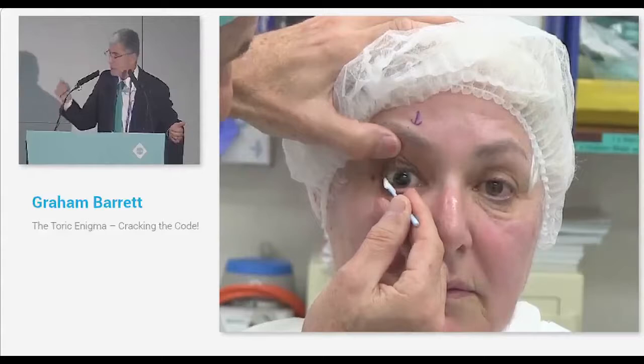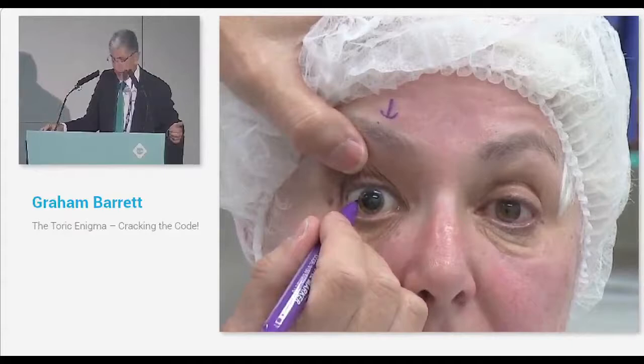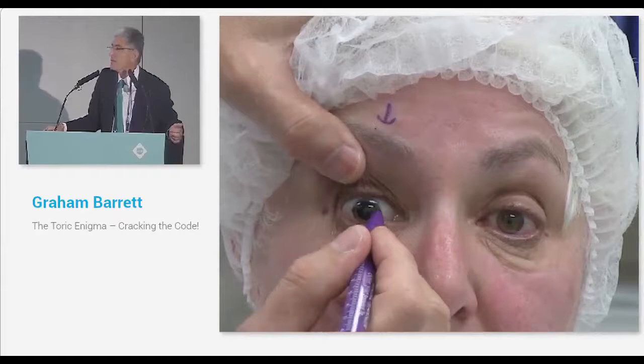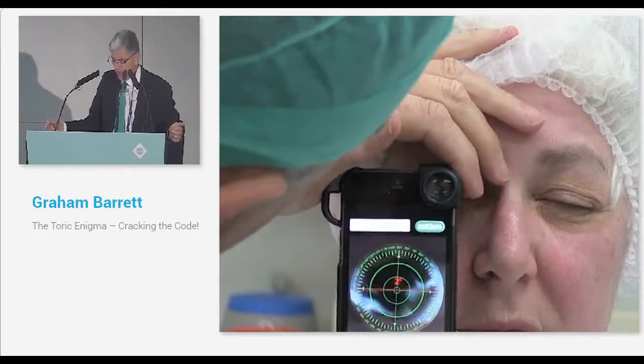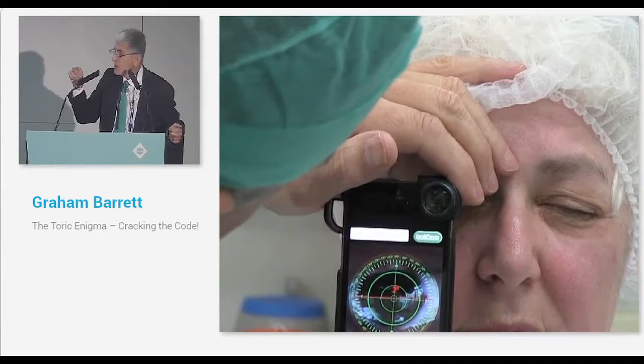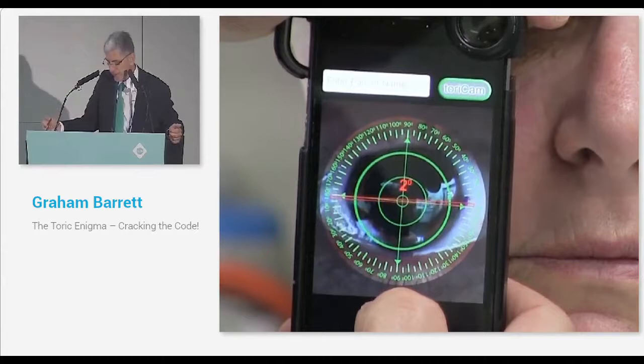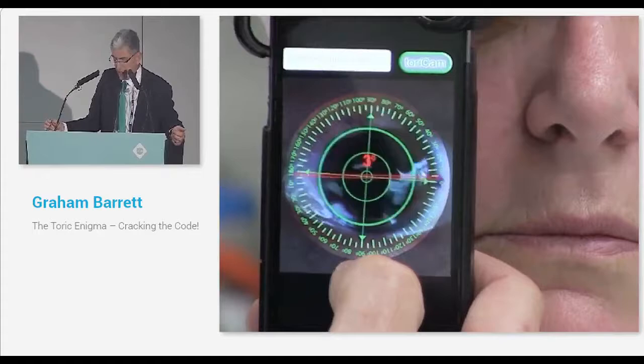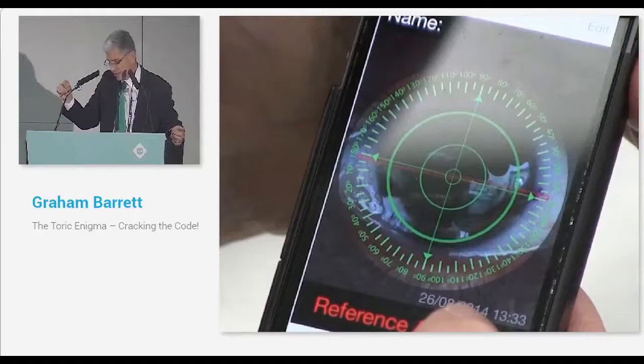Let me explain the system. Here's an actual patient. So I dry the limbus first, and I use the felt tip pen directly on the limbus. To me, this is the best way to get a mark which doesn't spread. And I estimate where I think 180 degrees is. I don't panic because if it's not 180 degrees, I'll find out. Because what my app does, I look at the eye, support my phone with my hand. And can you see what I'm doing? I'm using the red reference axis, which is controlled by the accelerometer within my iPhone, to show me the actual degrees of my reference mark. There's a little button there which I'm pressing, and it's capturing that image.